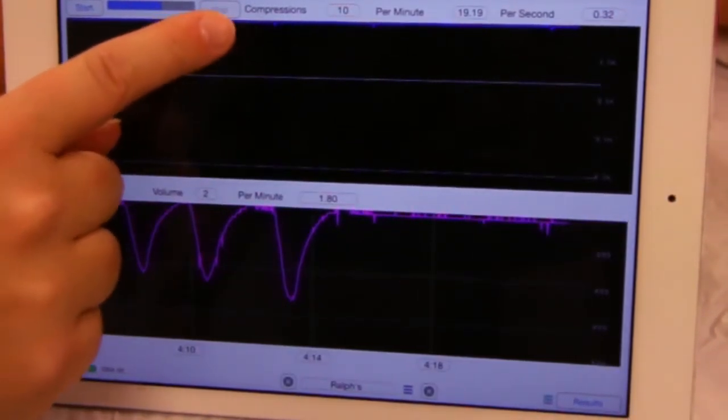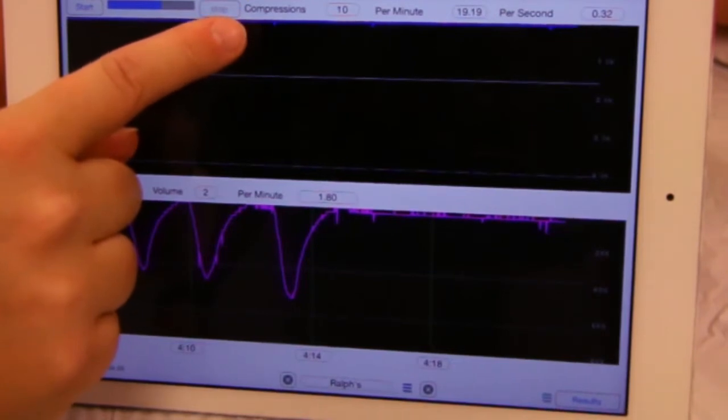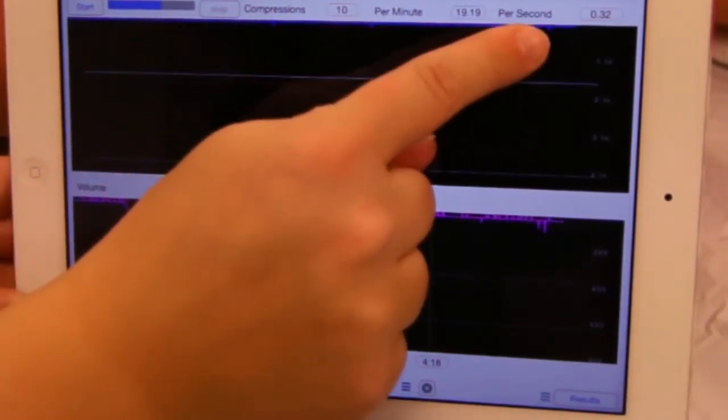On the control screen, data is shown for completed compressions, including rate per minute and per second.